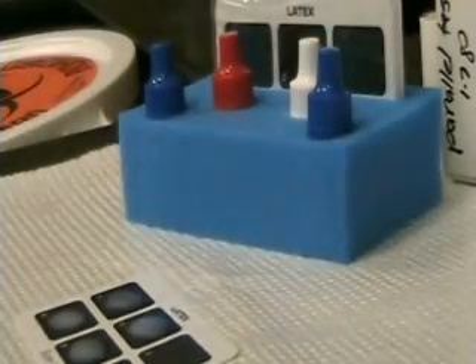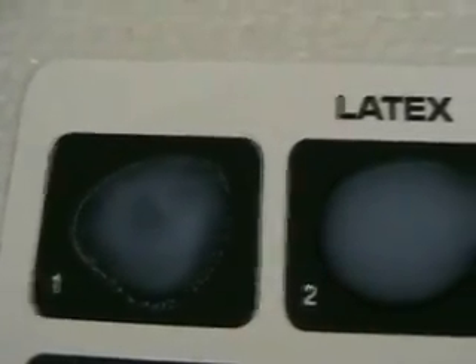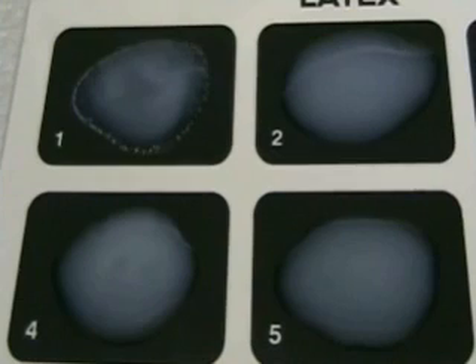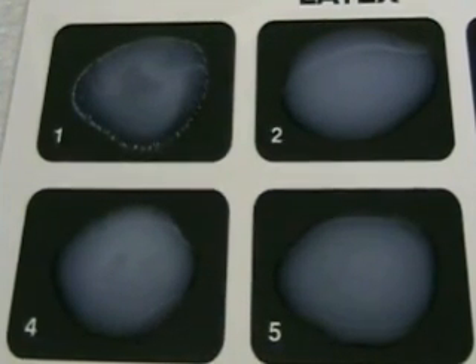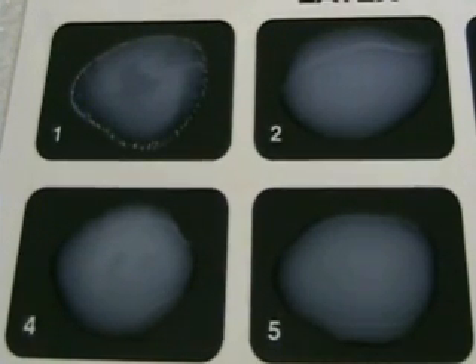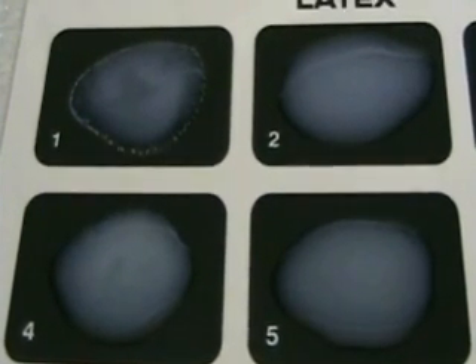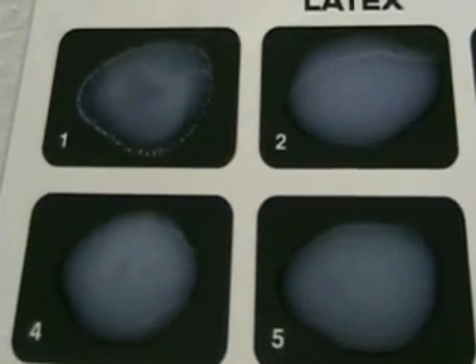Now place your card on the benchtop and check each square for agglutination. Remember, control 1 is the positive control in square 1 and we get positive agglutination. Square 2 is the negative control, and squares 4 and 5 are patient specimens. Squares 2, 4, and 5 show no agglutination and would be recorded as negative for rheumatoid factor. Control 1 is positive.